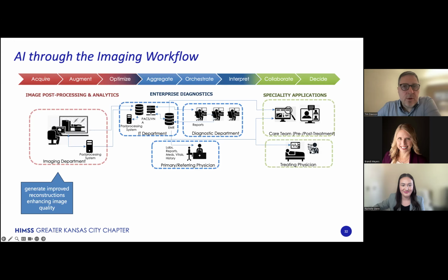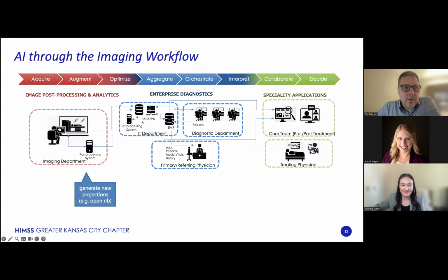There are scanners out there that use AI to generate much improved images with lower noise. We can generate new projections, new ways of looking at the images. So instead of a CT image that's just looking at top-down slices of the body, you can take the rib cage and fold it open. A radiologist will have a much easier time detecting a rib fracture, for example, with a tool like that than they would just scrolling through the images.